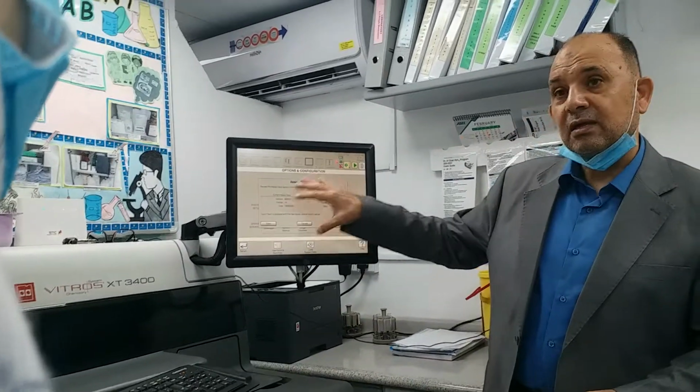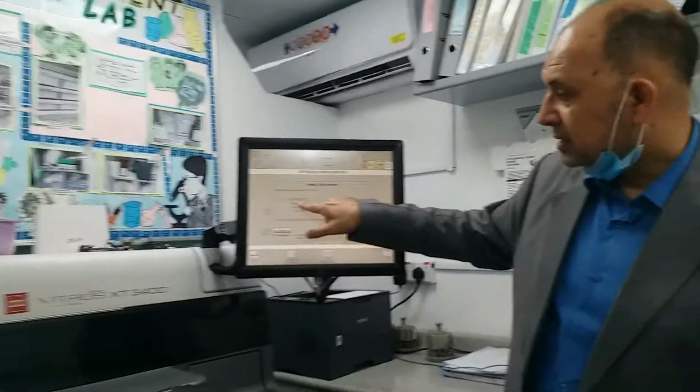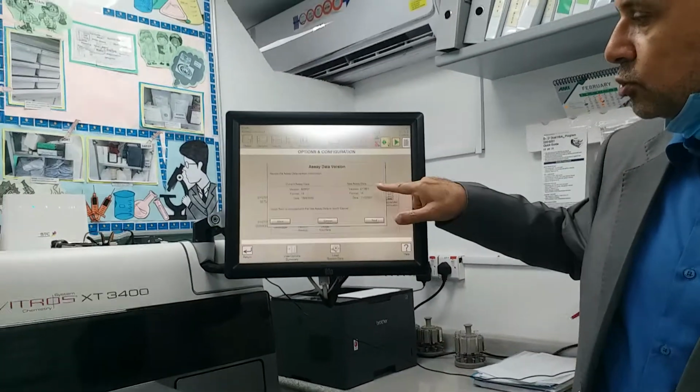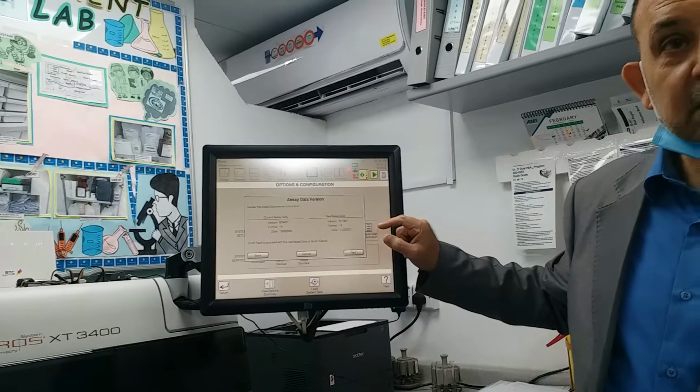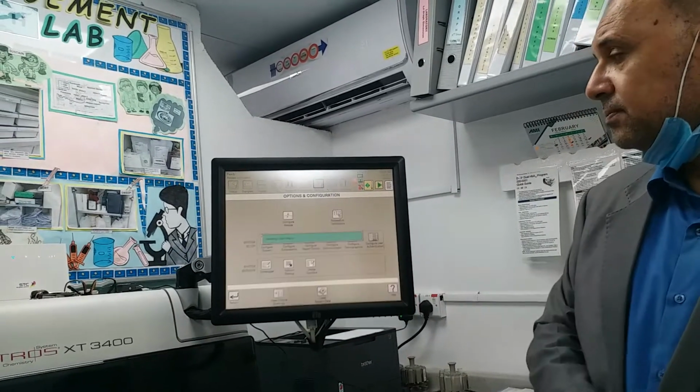Now it tells me that I'm going to change from 609 401 to 611 801. Okay, I agree with that. Yes, I agree. I tell next.